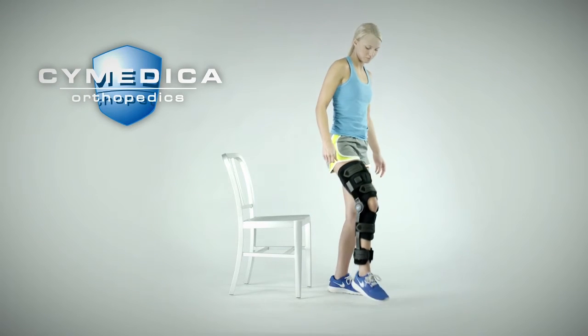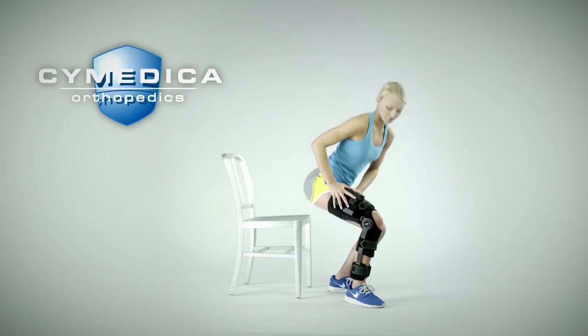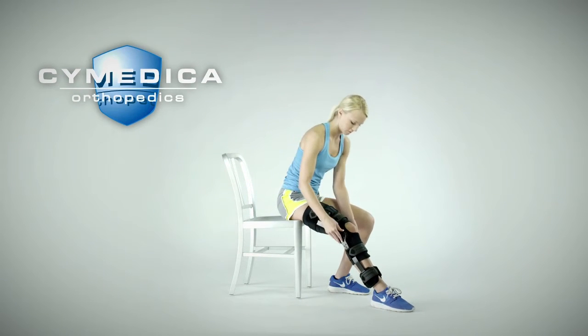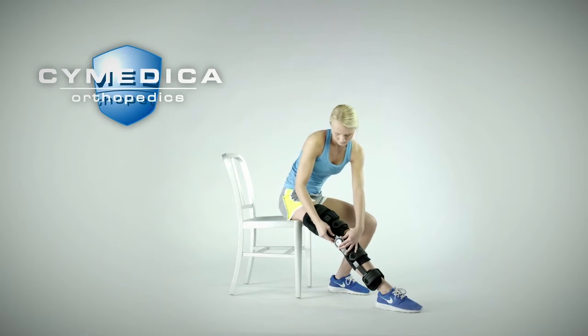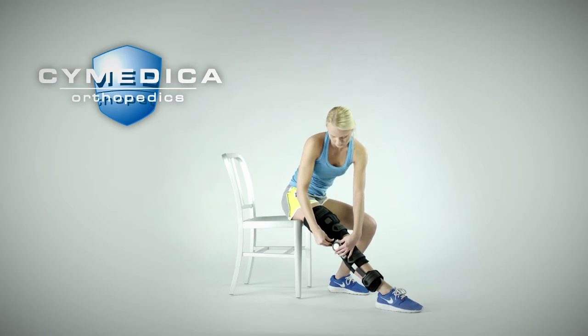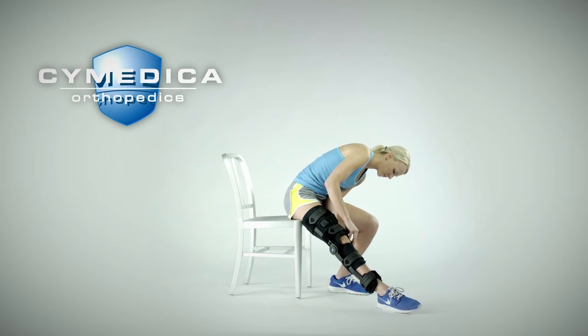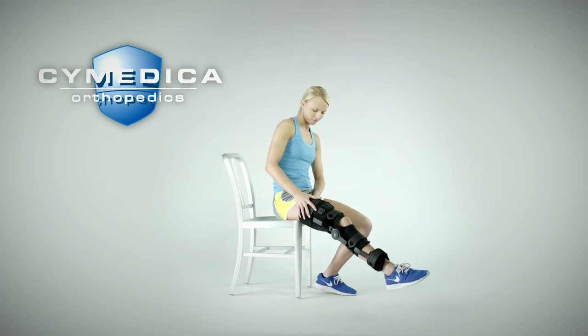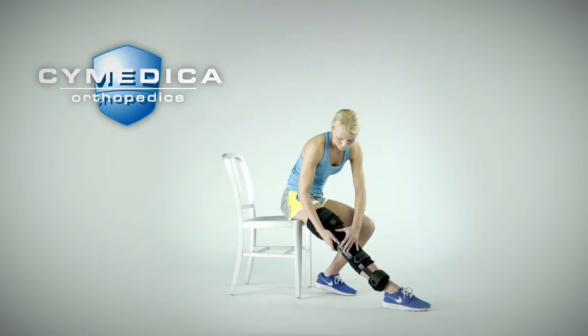Stand up and bend the leg and walk around with the brace to assess the fit and adjust as needed. As part of your rehabilitation process, your physician may indicate that you should keep your leg locked in extension. To lock the brace in extension, fully extend your leg and engage the slide lock on both sides of the brace. Depending on your injured knee flexibility, you may need to push on the brace gently to get into full extension.